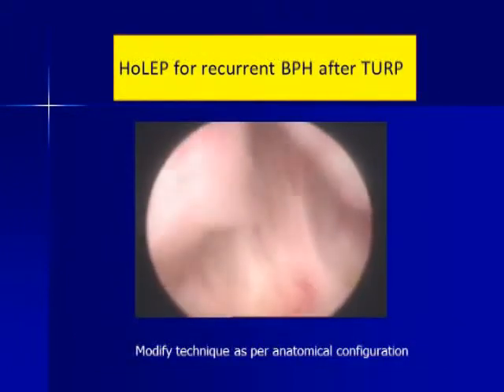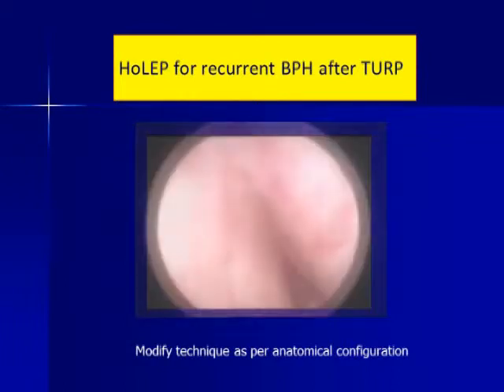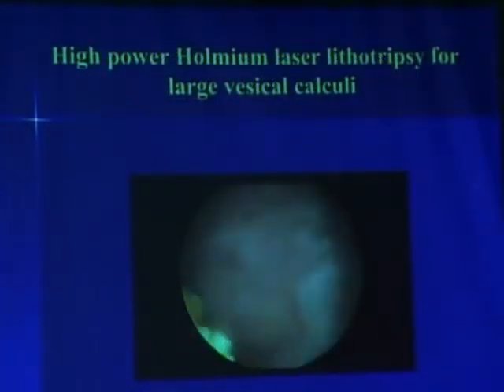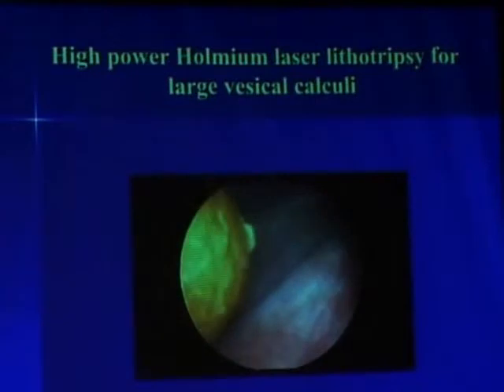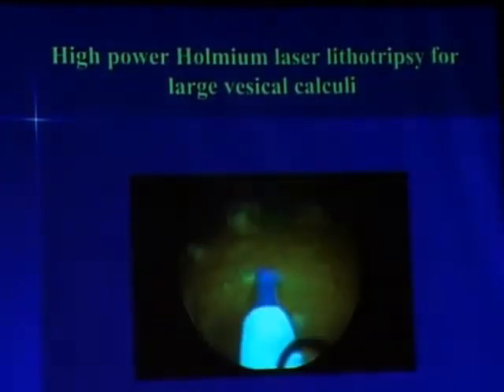Even recurrent prostates, we need to study the anatomy and deal with them accordingly. Bladder stones of any size can be dealt with this laser. Being a high power laser, larger stones can be treated rapidly by using higher energy. We can go up to 60 or 80 watt.